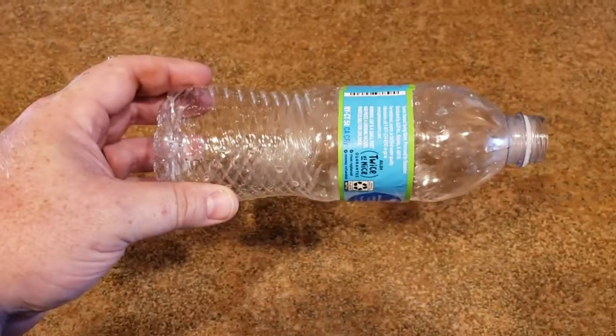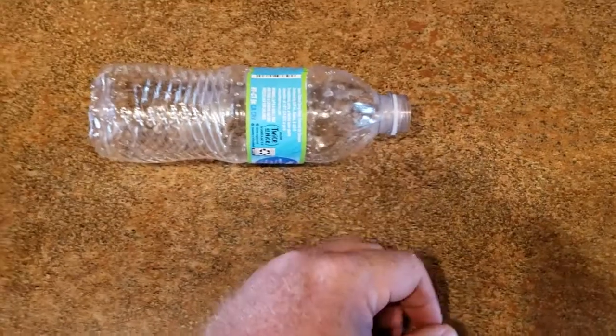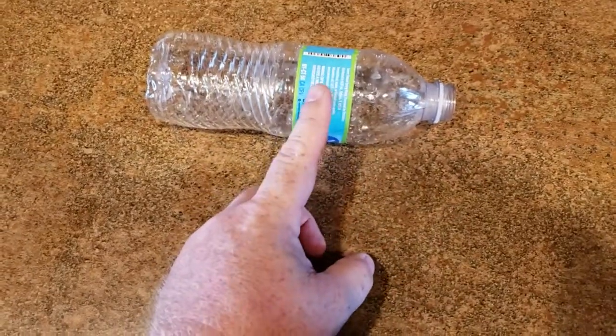What I'm going to do is cut this bottle in half here, and we're going to keep the side with the cap and the lid first. And I'll be right back. I'm also going to remove the label here just so it's easier to be visible inside of there.